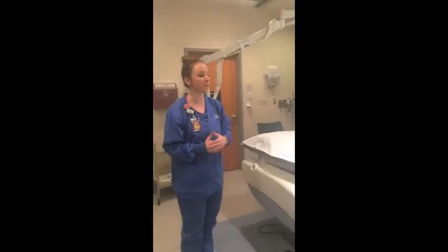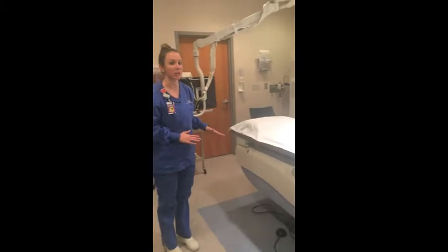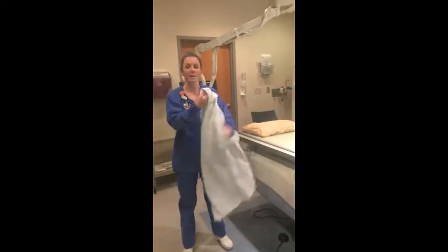Obviously, when the patient is being removed from the table, you can move the table all the way to the right, bring the stretcher in, and have the patient move over, and then the procedure will be finished. So you'll just take your sheet down and clean the room.